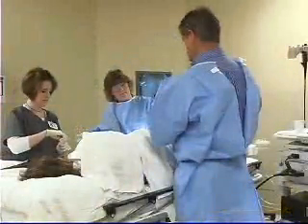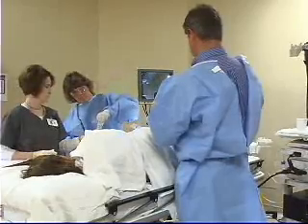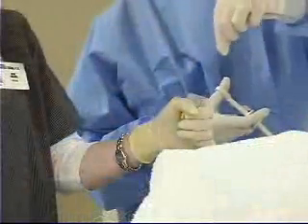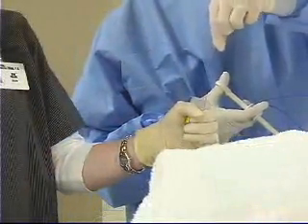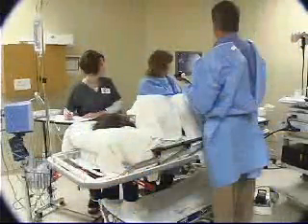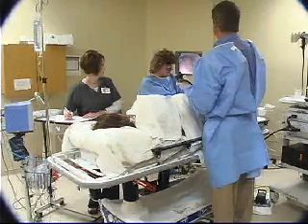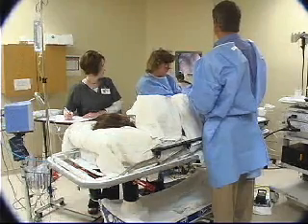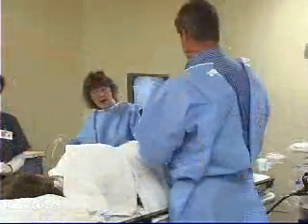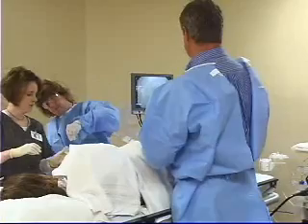A biopsy is a procedure in which a sample of tissue is taken from inside the colon, esophagus, stomach, or duodenum. The sample will be sent to pathology for testing. Your physician may find a polyp or growth inside the colon or stomach. The physician may remove these growths using several techniques. The sample may be collected and sent to pathology for further testing.